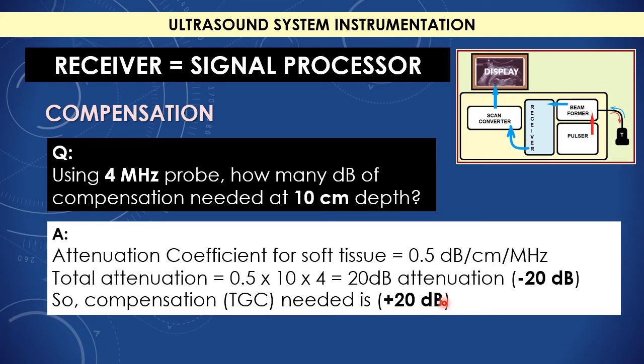So if adding decibel to the right side, how many decibel? 20 decibel. So when I move that sliding bar to the 20 decibels, I'm compensating for the negative 20 decibel that happened with attenuation. All right, guys? So this is how to answer this question.